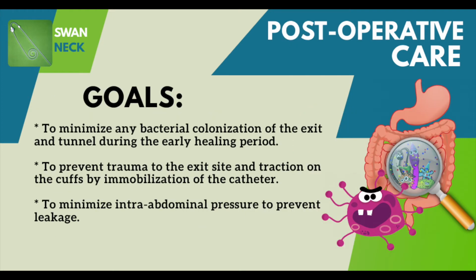The goals of postoperative catheter care to the patient are also as follows. Minimize any bacterial colonization of the exit and tunnel during the early healing period. Prevent trauma to the exit site and traction on the cuffs by immobilization of the catheter. Minimize intra-abdominal pressure to prevent leakage.